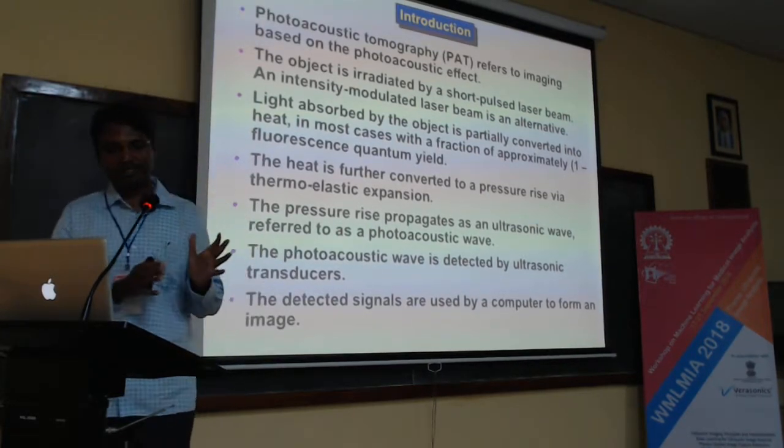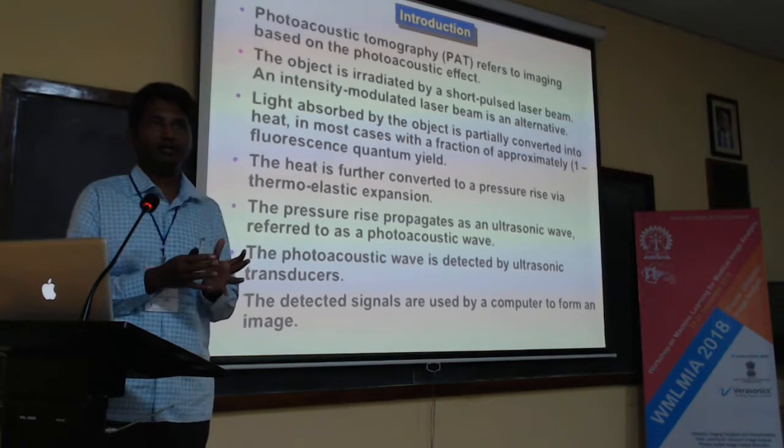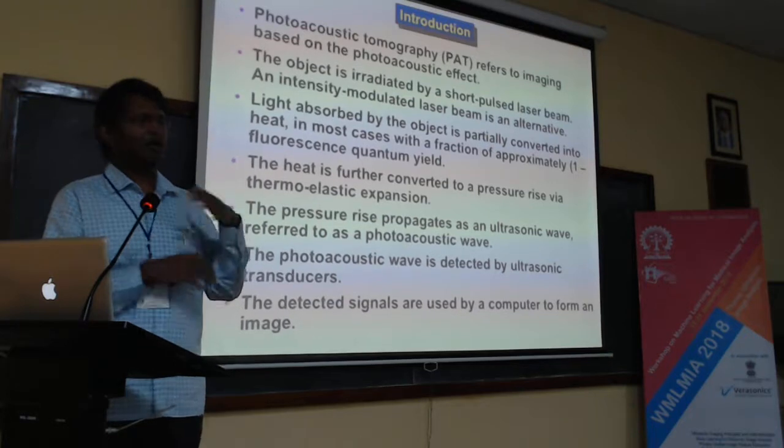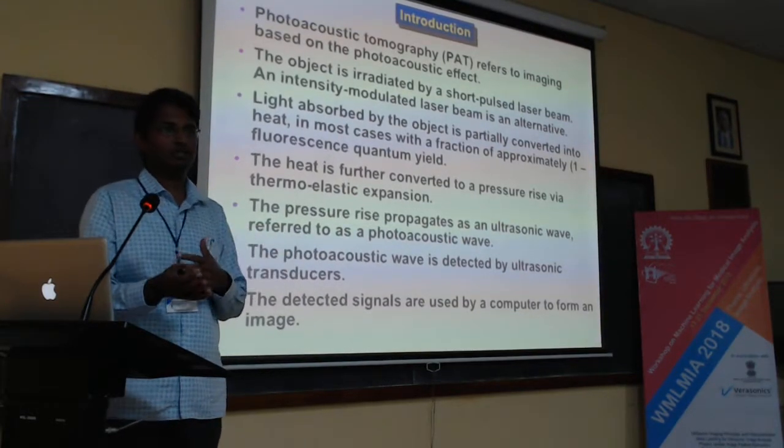So that means that the detected signal now has to be processed into the reconstruction. And then you have to do the reconstruction so that you can get the initial pressure distribution. I'll talk about how the initial pressure refers to the tissue physiology or pathophysiology as we move along.